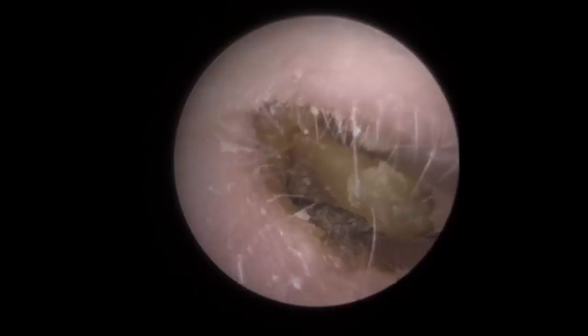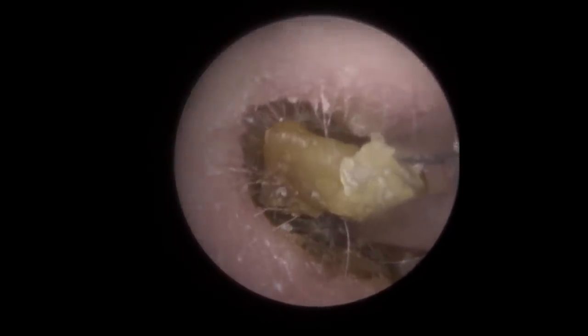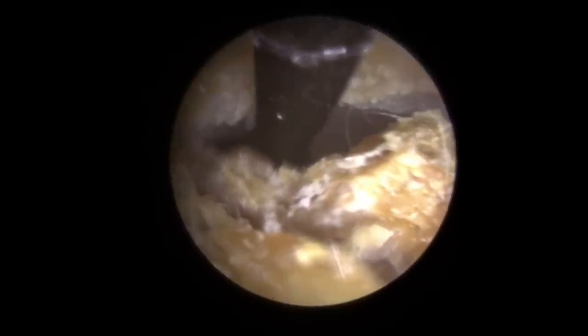So we're going to move on to the second ear now. You can see a very similar issue — lots of wax just inside the canal. So we're going to use the crocodile forceps again, getting a grip on this angular piece at the front section and using gentle but steady pressure just to take this out very, very slowly to avoid any tearing or breaking of the wax. That came away nicely. We've got a little bit of a gap at the top and some dry skin at the top of that ear canal. So we're going to use the St. Bart's hook now just to come in and get behind this piece of wax. The first time we went in we just touched the back end of the wax and couldn't get the full turn, but going a little tiny bit further in we got that full turn — it's now behind the wax.